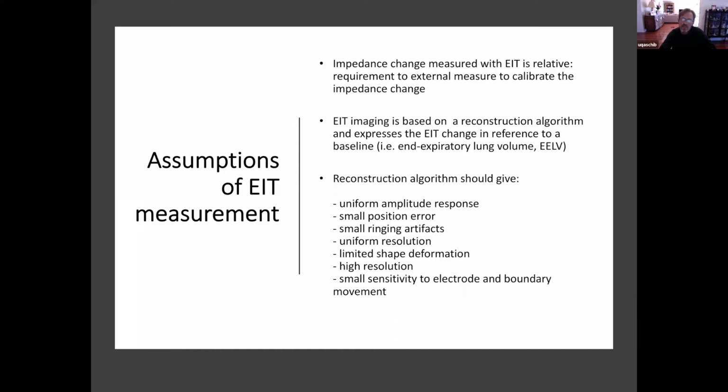The EIT imaging is based on a reconstruction algorithm, and the reconstruction algorithm assumes a certain chest size and shape and volume of the lung within that chest, and it's only as good as the reconstruction algorithm used.